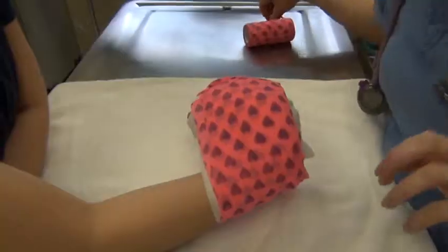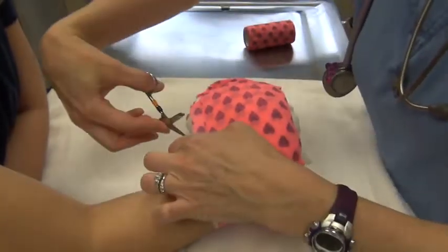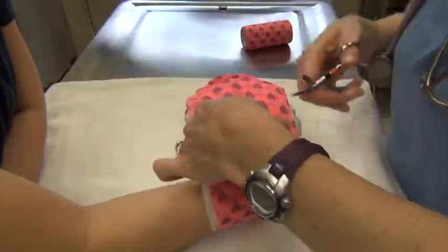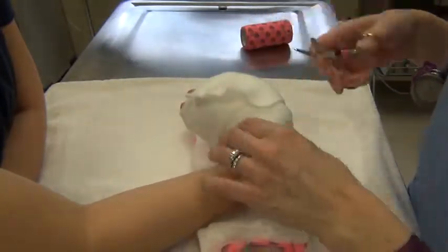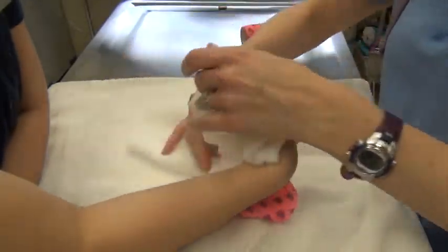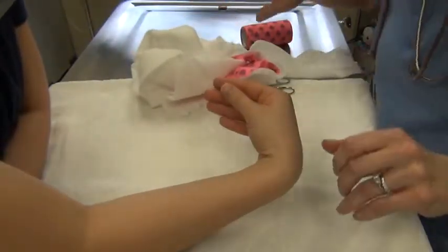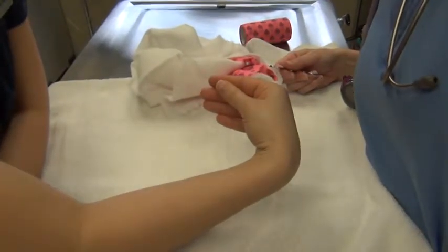Okay, now we're going to remove the carpal flexion splint. I'm just going to cut here. Be really careful not to cut the leg. I'm just going through the layers of the material. And we can go ahead and peel off the rest. Okay, and that's the removal of the carpal flexion sling.